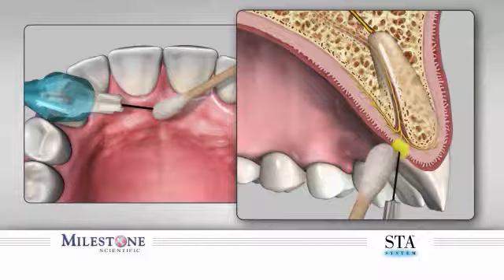The technique of allowing anesthetic to contact and diffuse through the outer layers of tissues produces a topical anesthetic effect, numbing the surface. Do not allow the needle to puncture the tissue this time. Continue to allow the needle to stay on the surface for another 4 beeps before initiating needle penetration.